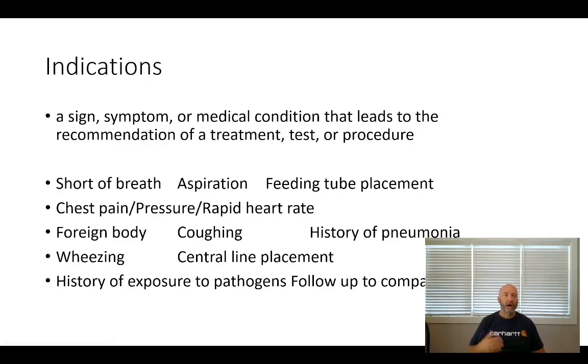So the most common 2 chest x-rays that we're going to shoot are an AP or a PA. If the patient can come to the department, we're probably going to do a PA and lateral, but in a lot of cases, the patient can't come to the department. Or if they can come to the department, they can't stand up to perform a PA projection. Projection is what I'm referring to with PA.